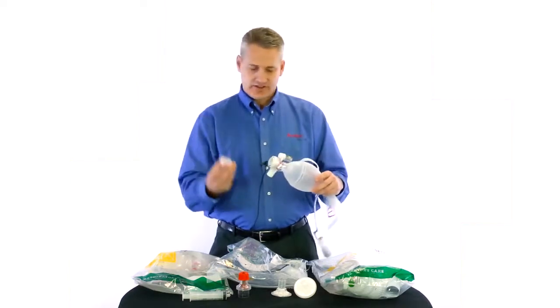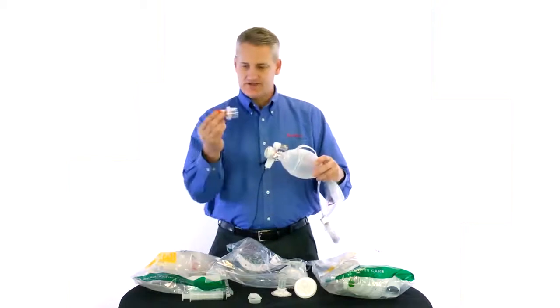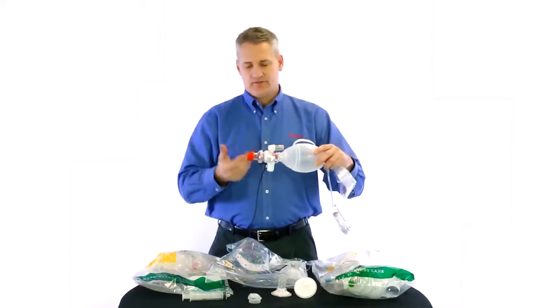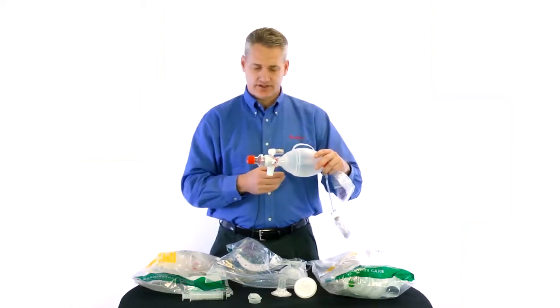Moving forward, we have our deflector cap, which we talked about. To put a PEEP valve on, you just take that off. We have a standard Ambu PEEP valve here. You put that on with a twist, just like on our adults. It will create a friction seal, and from there, our PEEP valve will stay secure and snug while you're administering it.